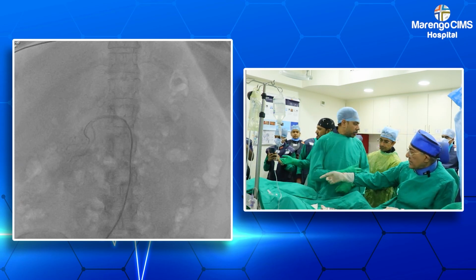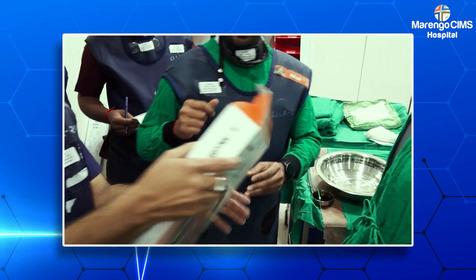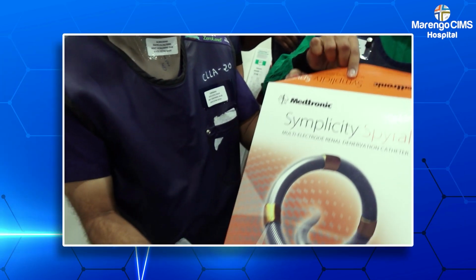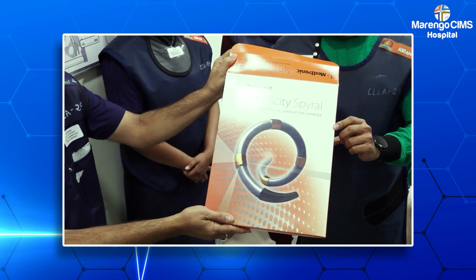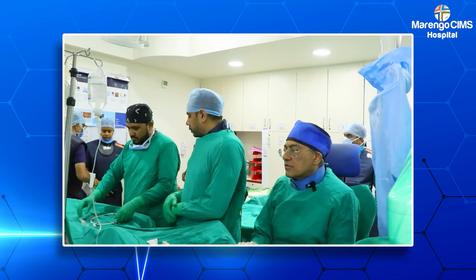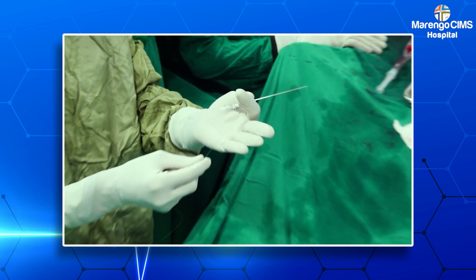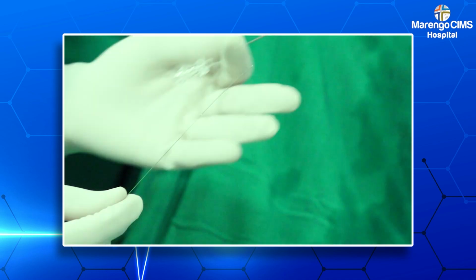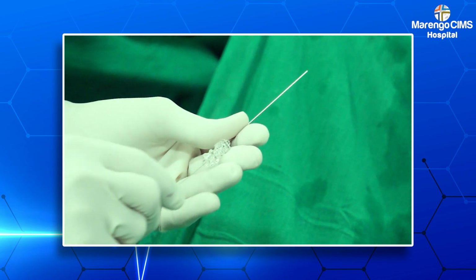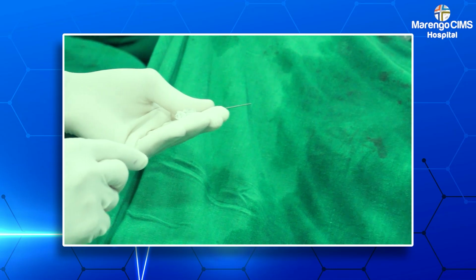Tejas, why don't you come up and show the Grand Slam being introduced? Let's open up the spiral catheter. Patient is right now lightly sedated. Once we are ready to ablate, before that we'll sedate her much more. So this is the Grand Slam wire, which is a 014 wire, but a little bit stronger wire which gives good support to the catheter.